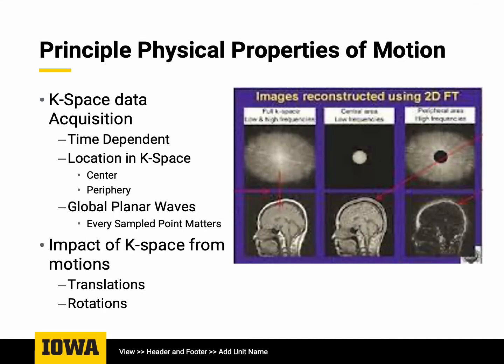As we've learned in our course and is illustrated in this paper, collecting the data for the MRI is time consuming as we move through k-space to acquire it. It's interesting that since different details in k-space are from the sharpness and the smoothness of the different edges, impacts in k-space from motion can affect the entire image. This is very challenging when trying to allocate what kind of a translation or what kind of a rotation and what the impact has. However, through the Fourier transform, we're able to visualize what those changes are.